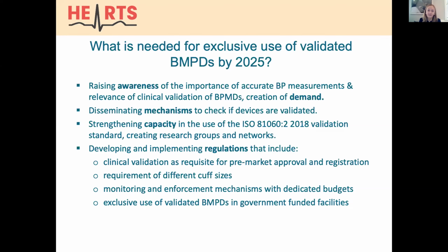And I think this is crucial: we have to develop and implement regulations that include clinical validation as a requisite for pre-market approval and registration. So only those devices will be sold in the country and imported, basically imported, because only 2 countries have the capacity to produce devices at this point, which are Cuba and Brazil, Brazil in a very limited way.